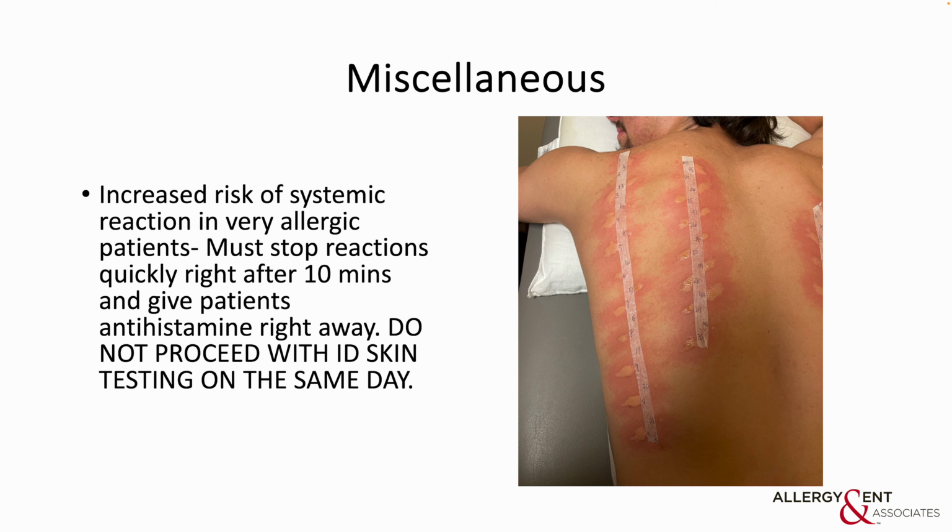You really want to look for a significant reaction at this point, after the 10 minute alarm went off. If that happens, I recommend you use a piece of tissue and gently remove excess liquid allergens on the patient's skin. This way we can prevent a worsening reaction.